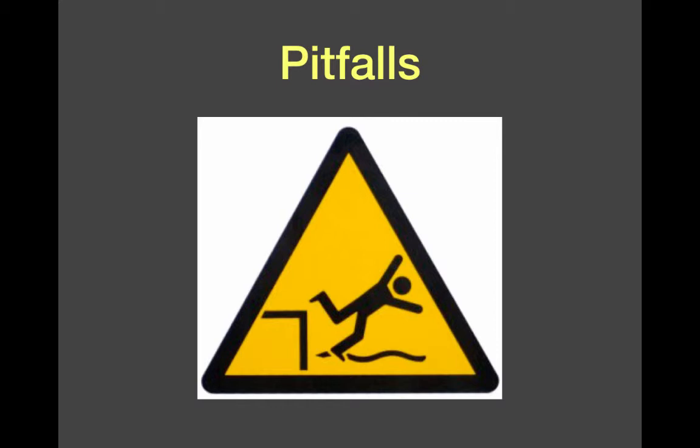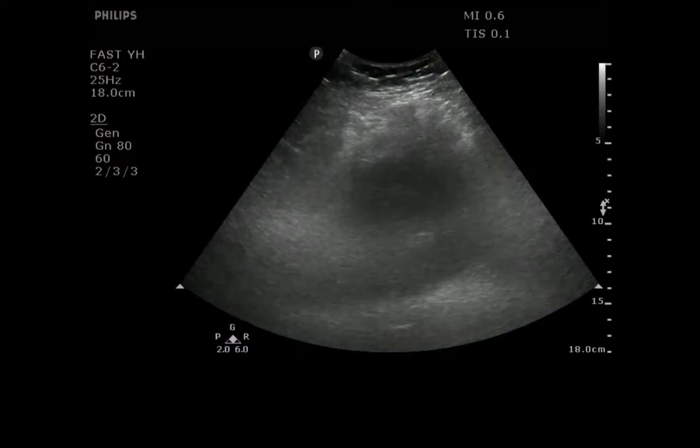We're going to move on and talk quickly about pitfalls. Like any point of care study, there are ways that you can get yourself in trouble. And like most of these ways, it's by not understanding what you're looking at, not understanding the anatomy, not understanding the technology that you're using.